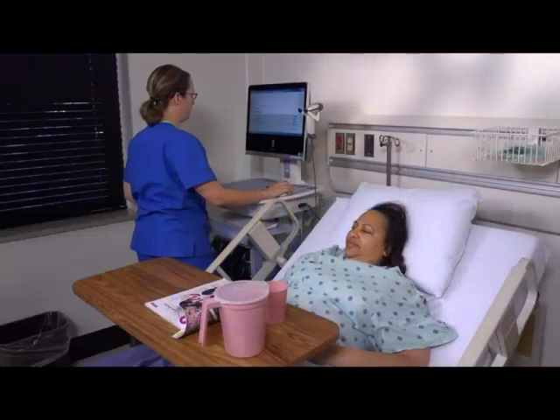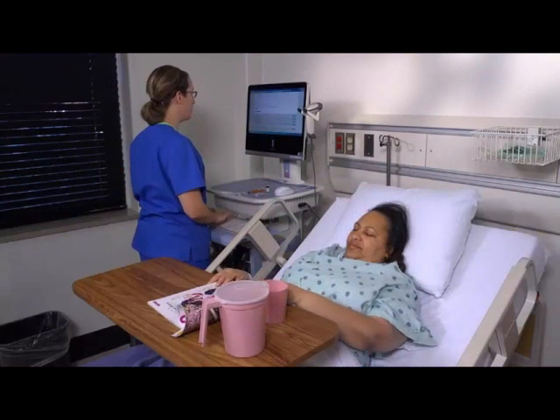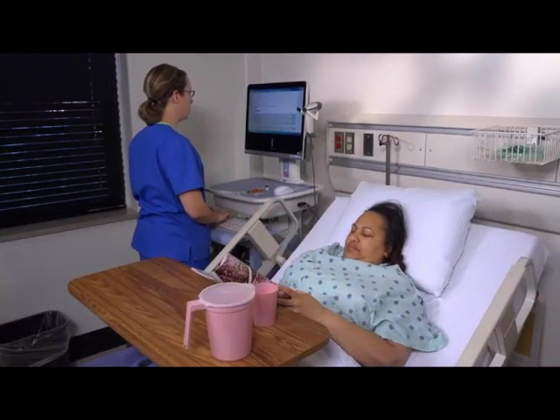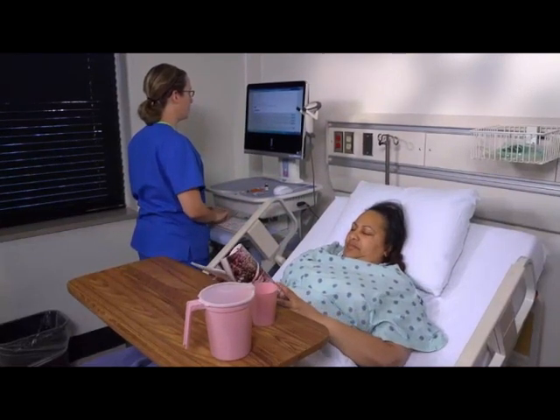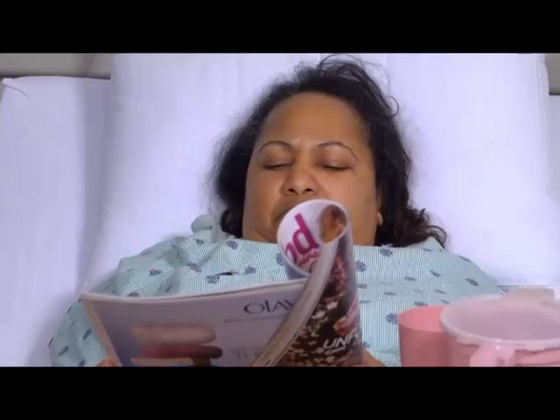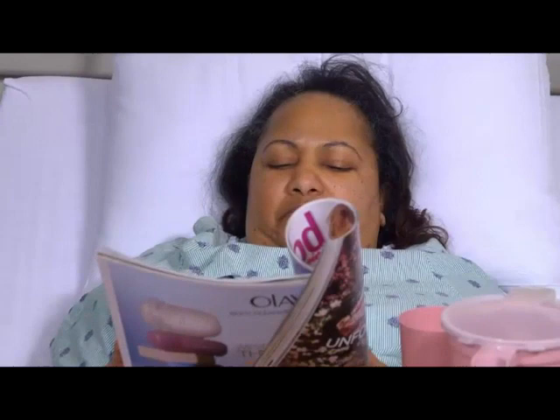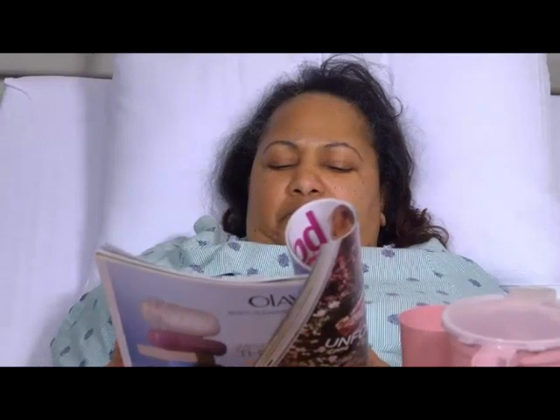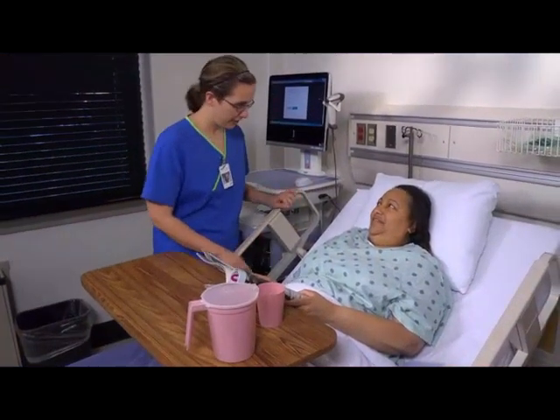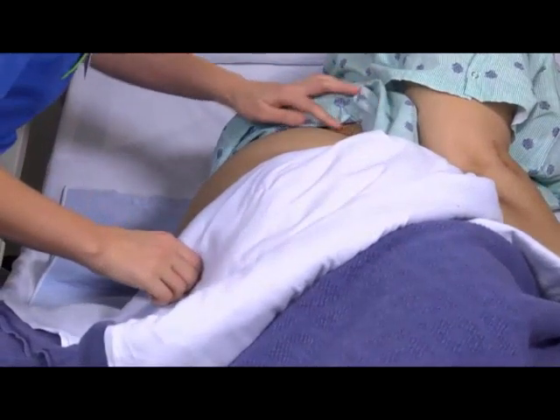Document the injection immediately in the MAR, including the medication name, the dose given, and the site at which it was injected. As part of your follow-up care, remain with the patient for several minutes to watch for signs of an allergic reaction. Return to her room in 15 to 30 minutes to see if she's had any acute reaction at the injection site.